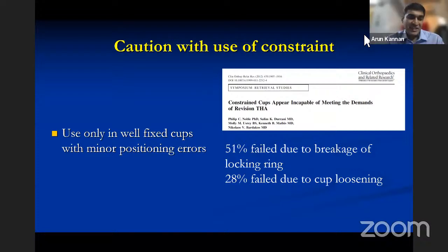No, sir. There have not been too many studies, but a few have actually shown that wear in dual mobility bearings is comparable to or even slightly lower than standard bearings. The reason is that most of the movement happens at the smaller diameter junction, between the head and the poly.